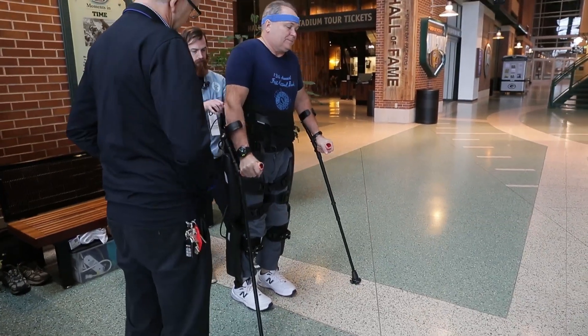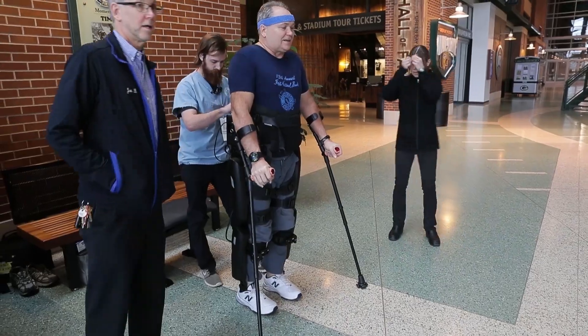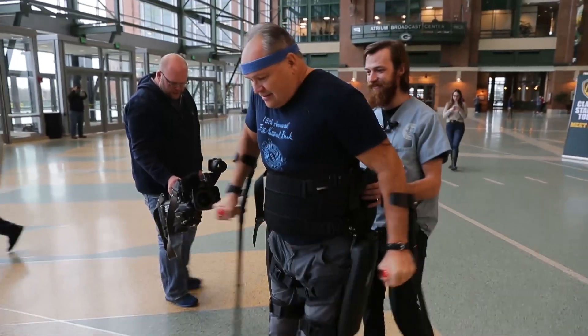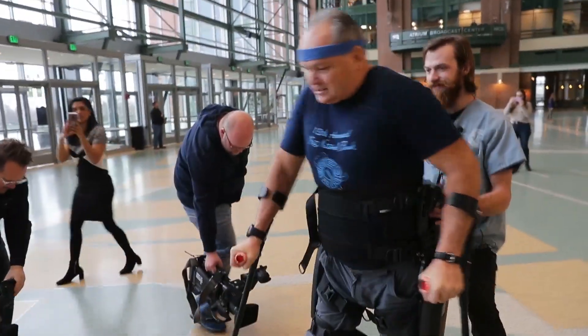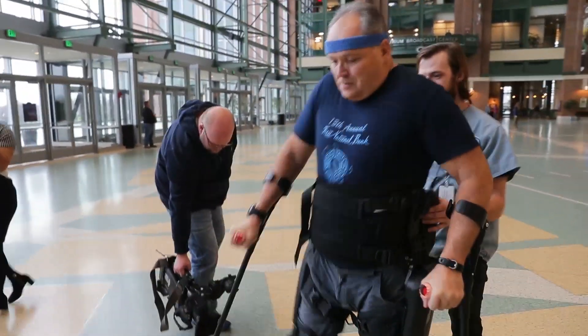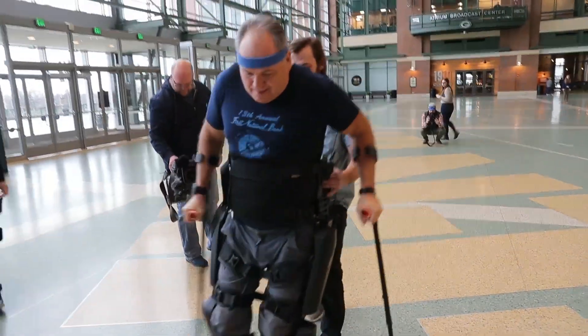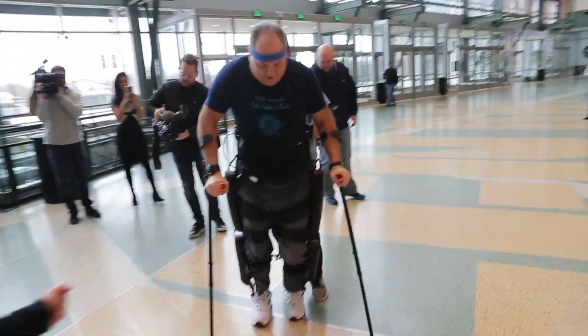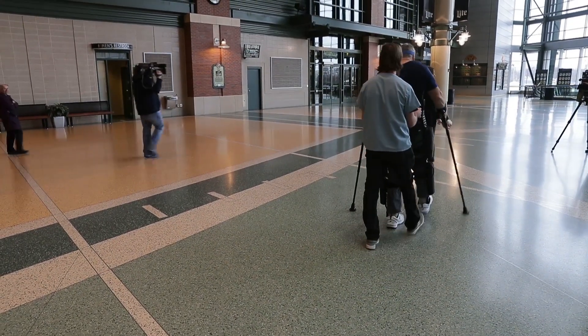Find out how bad my spasms are. Basically the more I sit still the more spastic I get. I liken it to an able-bodied person learning to walk on stilts — if you're walking on stilts you have to feel the ground through a wooden or metal leg. That's basically what I'm doing through the robot, because I'm completely paralyzed from my ribcage downward. So the robot is like my stilts, and I'm using crutches as well, so I have a three-point stance.